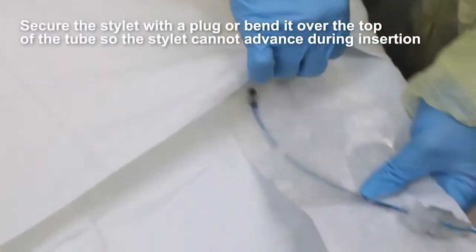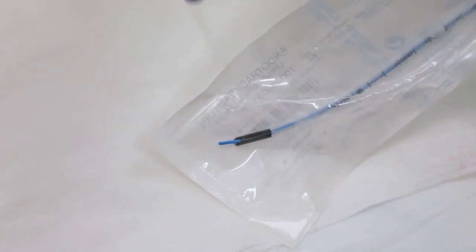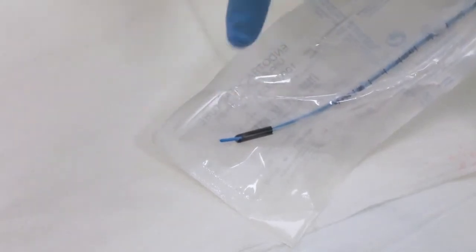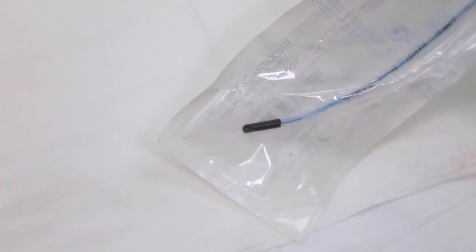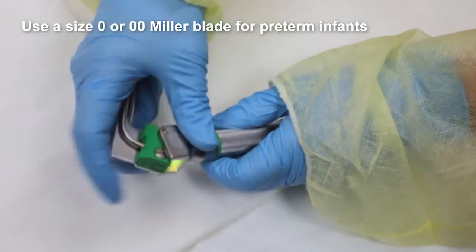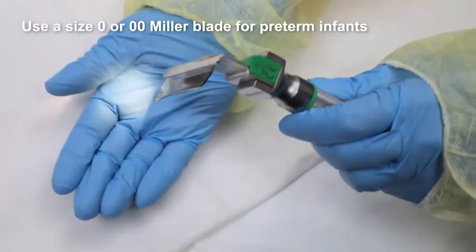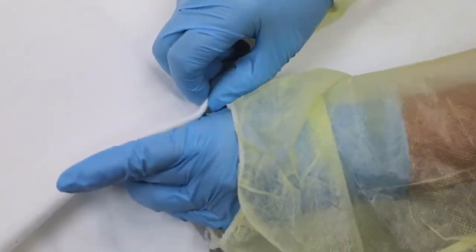A stylet provides rigidity and curvature for placement. Ensure that the tip does not protrude beyond the end of the tube. Make sure the stylet can be removed easily. Use a size 1 Miller blade. If the light is dim or flickering, replace the batteries or bulb. Place the laryngoscope on the operator's left side.